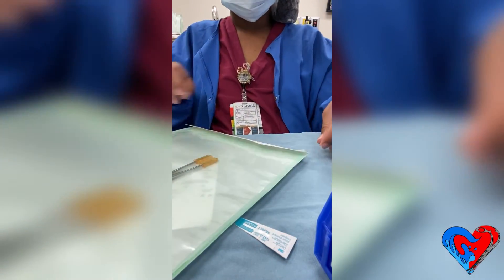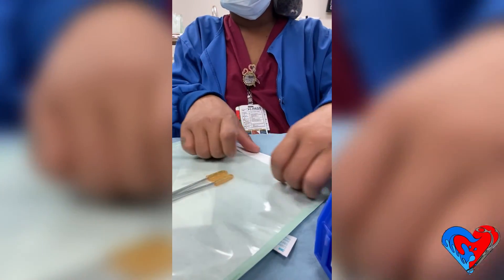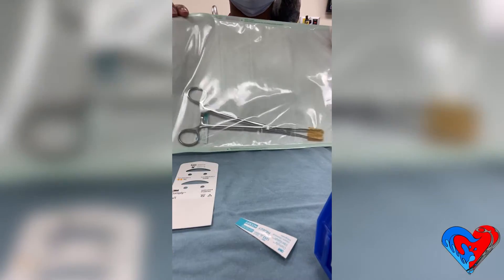I pre-fold to help my crease, then peel off the paper, flatten and tighten the pill pack, fold, and then seal — making sure it's a smooth seal.